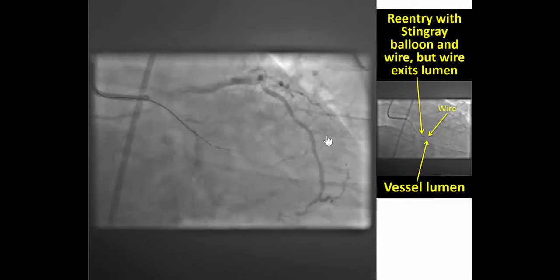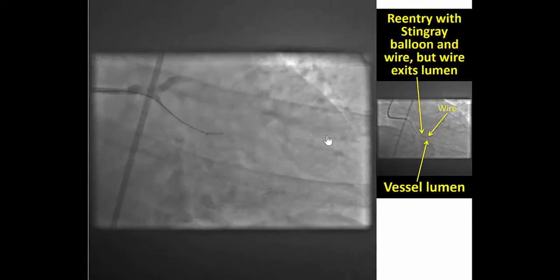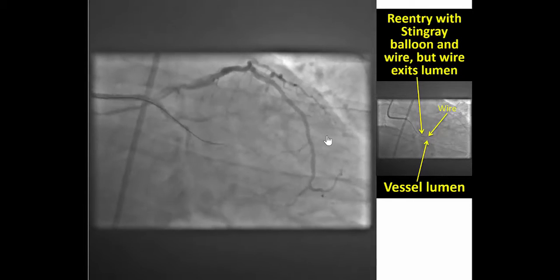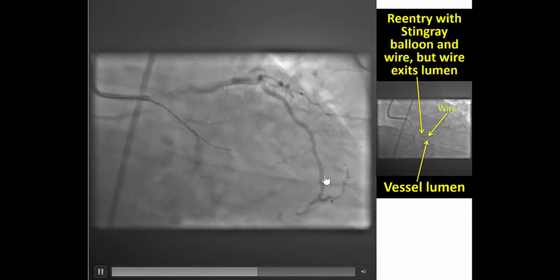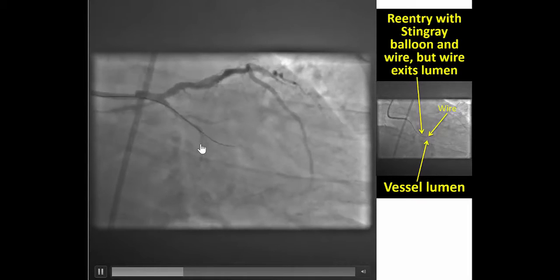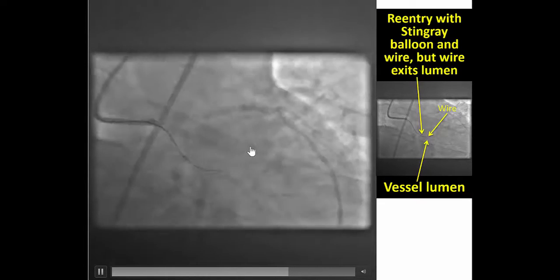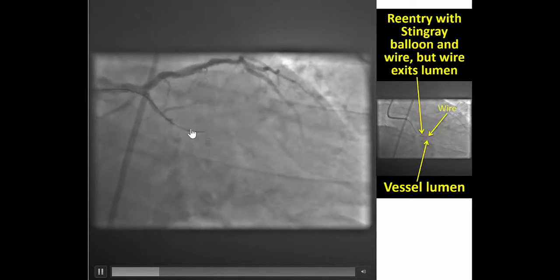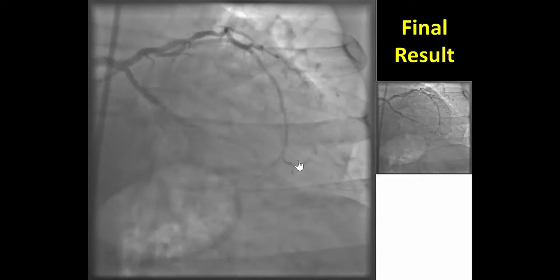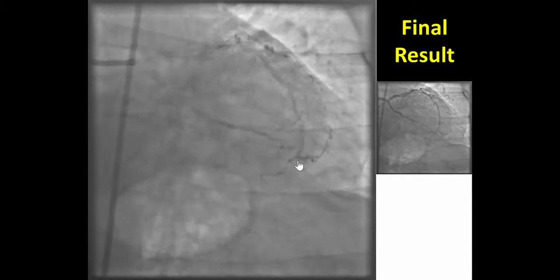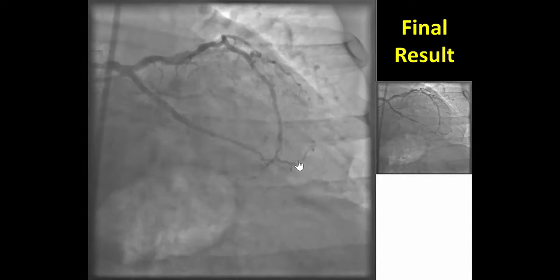After doing that, we advanced the guide wire a little further, and then on contralateral injection and ipsilateral injection, we do now see that the wire is dancing in sync with the vessel, suggesting we're in the same plane — although unfortunately the crossing was in the sub-intimal space. That is why we entered using the Stingray system. This is the Stingray balloon with the two little markers. We were able to stick with the Stingray wire, then swap for the Pilot N200 using the so-called stick-and-swap technique, which allowed successful crossing.